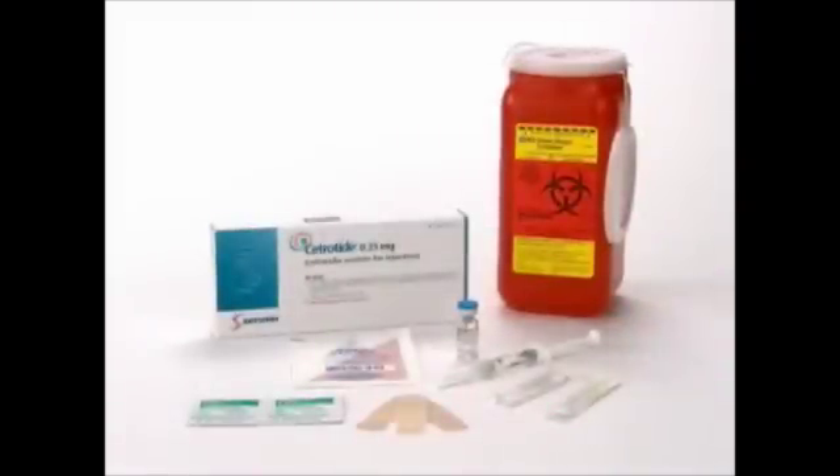Make sure you have all the necessary materials assembled in a clean area: one vial of powder, one pre-filled syringe, yellow mixing needle 20 gauge one and a half inch, gray injection needle 27 gauge half inch, alcohol swabs, and a safety container.